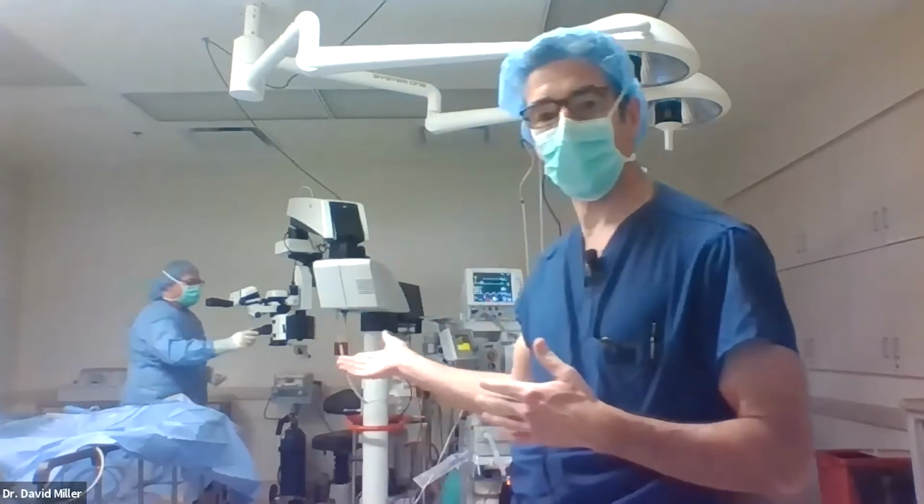My name is Dr. David Miller of Retina Associates of Cleveland, and we are going to present a surgical live demonstration of the basics of vitrectomy surgery for retinal detachment repair. We will begin the course with the didactics, some slides discussing the ins and outs of retinal detachment repair using vitrectomy in particular, and then we'll move to the live surgical demonstration right behind me.